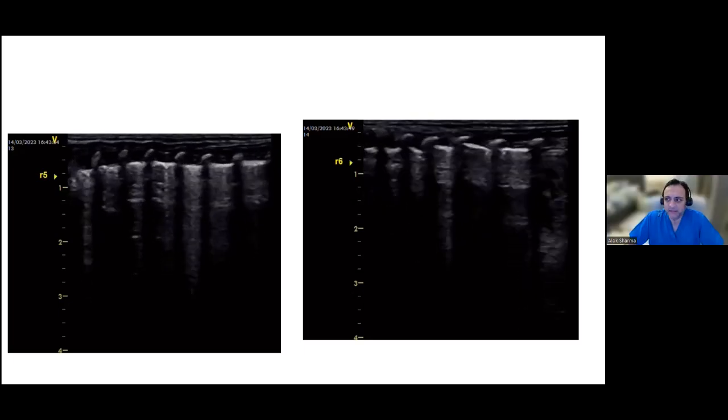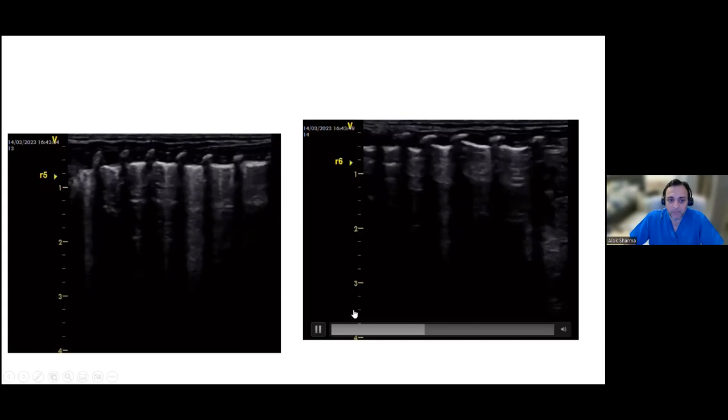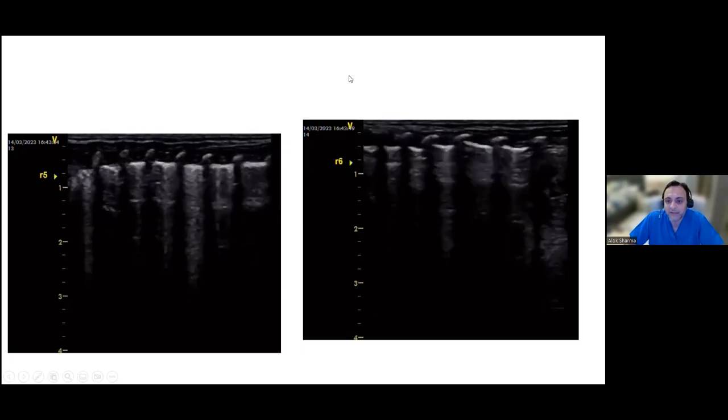So that's the beauty of lung ultrasound, that some of the changes that we're seeing, and you might remember from my talk, I said there's a real probability that we might have to alter the definitions of evolving lung disease, especially based on gestation. One of the classical problems is we try to define chronic lung disease for preterm babies between 22 and 32 weeks the same way, but actually there's a completely different spectrum of bronchopulmonary dysplasia for babies under 26 weeks, and even for babies 28 to 32 weeks it is a completely different spectrum. And that's where I suspect in due course lung ultrasound will in a big way help delineate phenotypes, to say, well, are we going to call this chronic lung disease? Are we going to call this evolving lung disease?